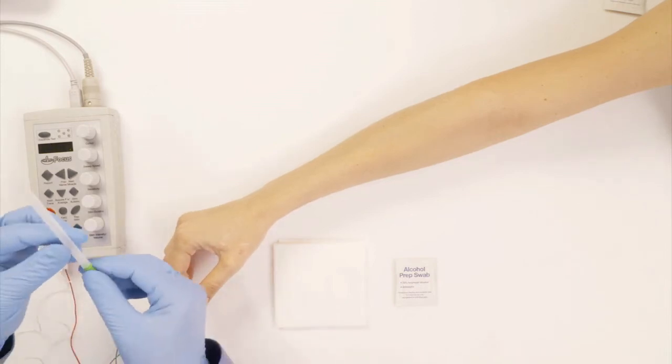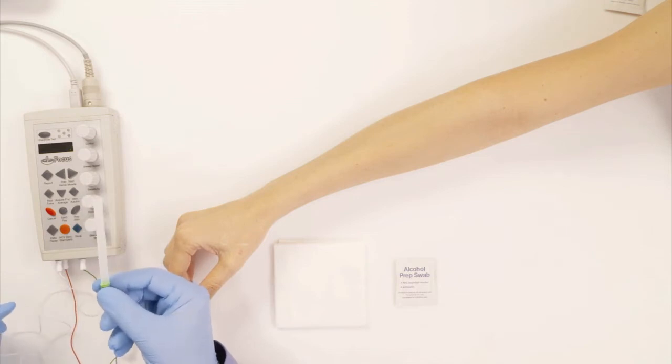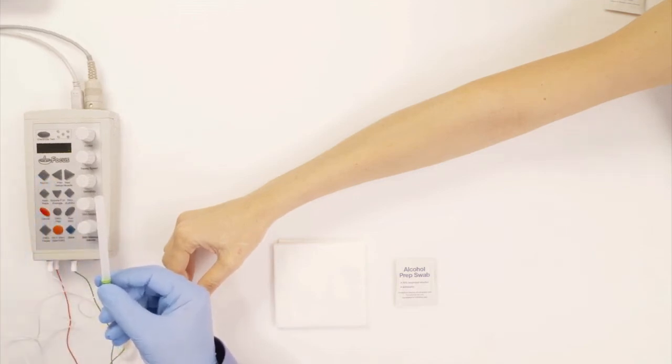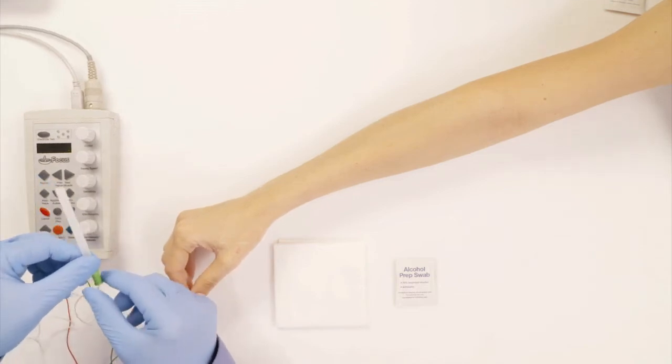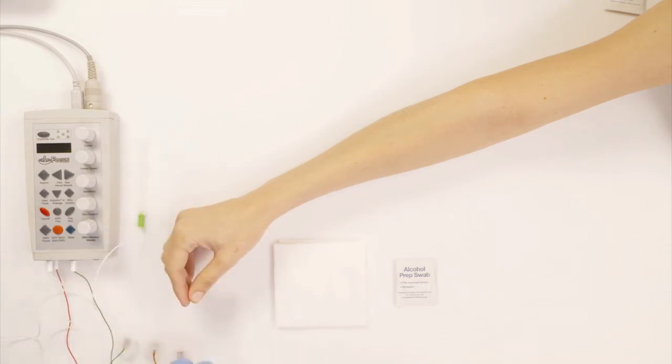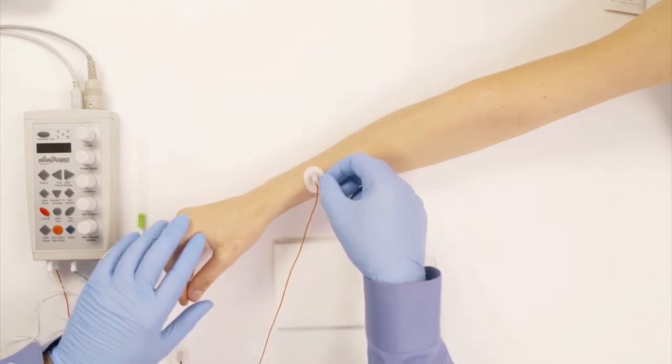So this is the needle. Again, it has sheaths to protect you from sticking yourself and making sure you don't stick the patient in the wrong place either. So I'm going to put this here. And now I'm going to put the reference electrode, first of all. I put it on a bone somewhere nearby. Make sure there's no muscle signals right there.